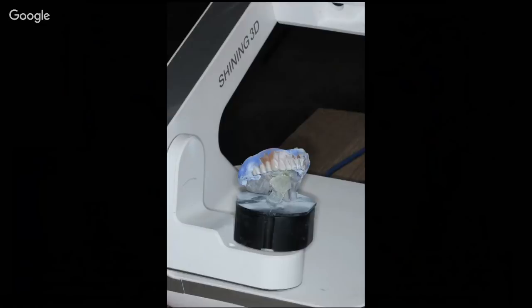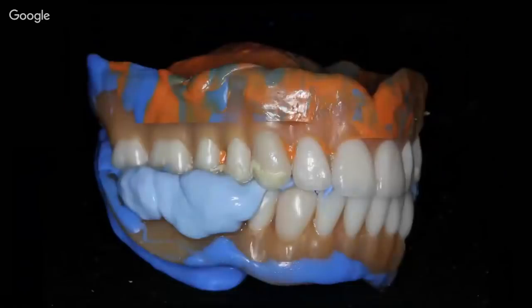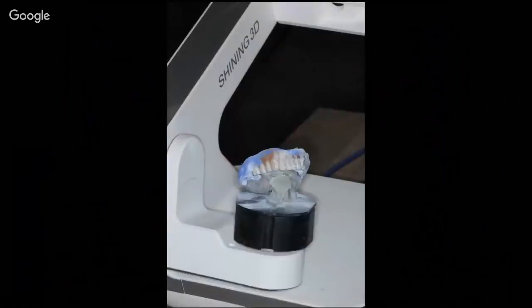And basically what I do is I call this a model. The scanner technically thinks it's scanning a model, but what I'll do is image this first. So rubber band these two casts together, and the scanner is essentially going to capture a buccal bite. That's what's going to be used to relate the upper and the lower master models together. And then I'm going to image each of the dentures individually.